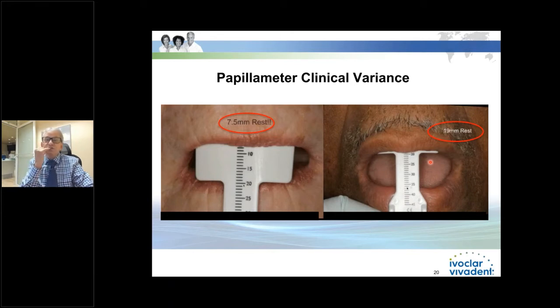You're going to want the occlusal rim to barely touch the lower lip when they say father, 55. If it bangs into it, then of course you're going to want to bring that back up, so you want to take a couple millimeters off of that. If they're not anywhere close, then you'd want to add to it. But doing this and giving the measurements to Kelley Dental Lab, you don't have to do that at all.